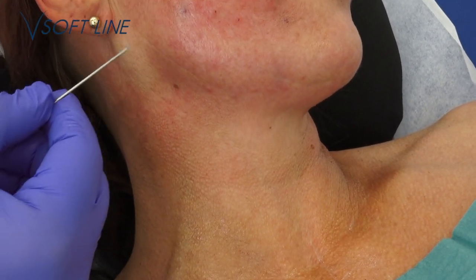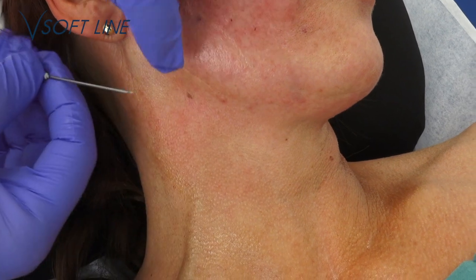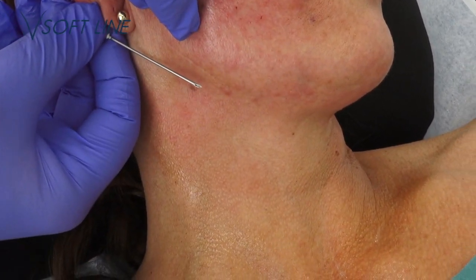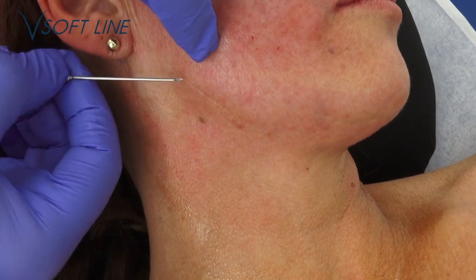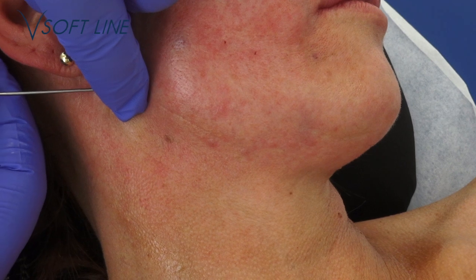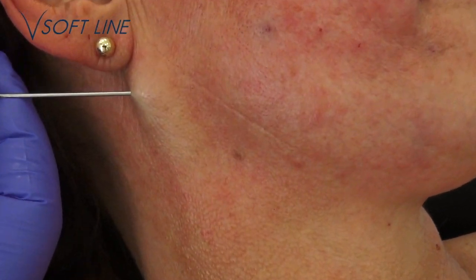I've already put local anesthetics here. You can see the adrenaline effect here. I use a 19G 40mm hollow cannula to make the entry hole. Ensure that the same entry point can access all the 4 locations, not too far towards the edge of the jaw, but just below and behind the ear. Enter the cannula only this deep, no deeper.